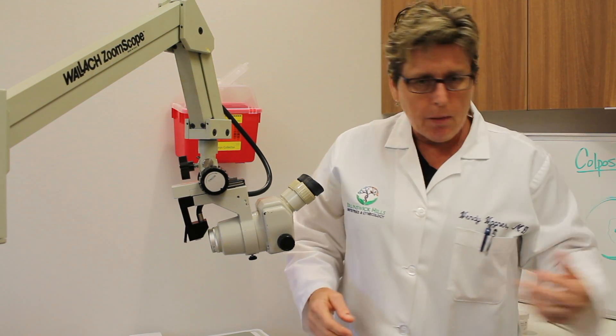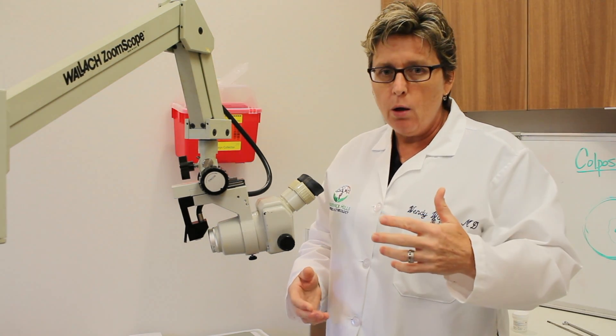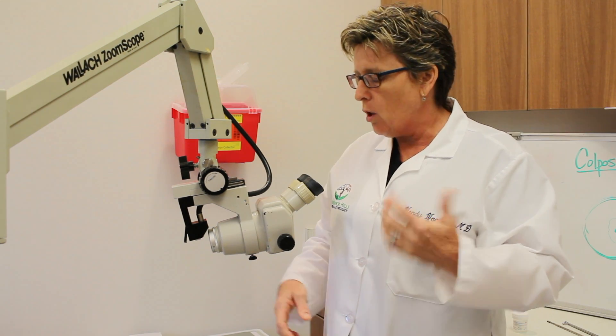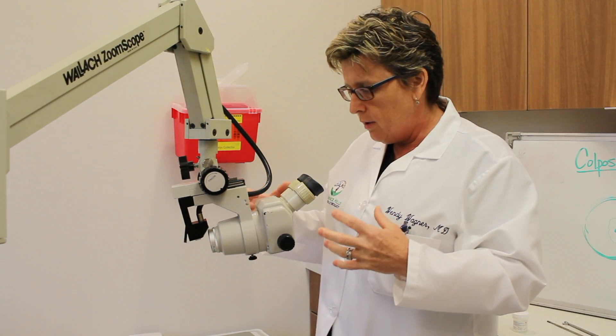What happens is the abnormal parts of the abnormal cells or the abnormal areas turn what we call acetyl white, which is white, and we can see that.